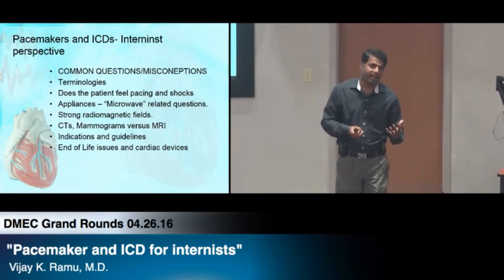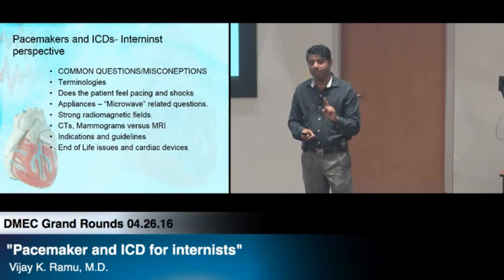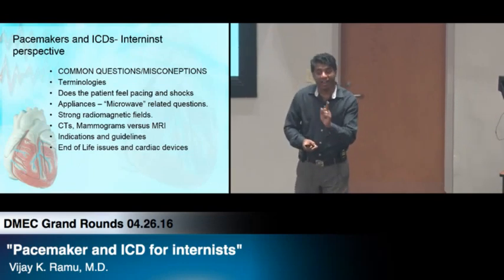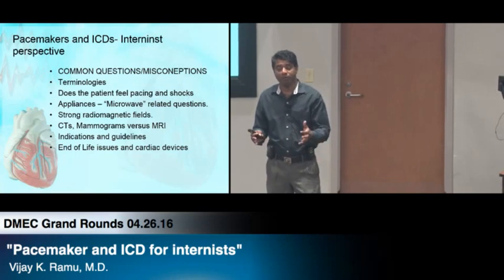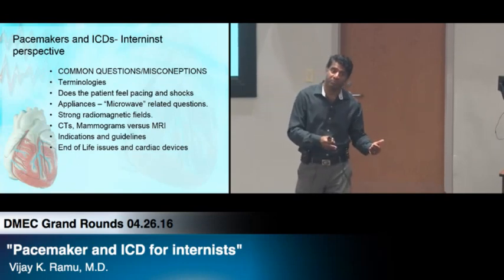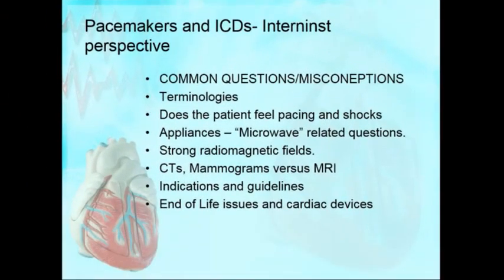So what has happened in the last 7-8 years, one company came up with an MRI safe pacemaker and leads. And then everybody started, now they're moving slowly to even defibrillators being MRI safe. It's not standard. Even to this day, if 10 devices are put in Johnson City Medical Center, there's a good chance 9 of them are not MRI compatible.